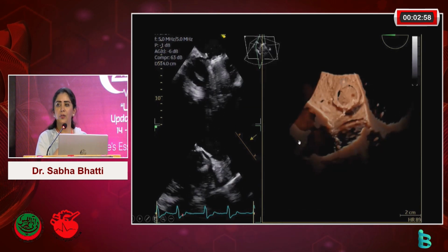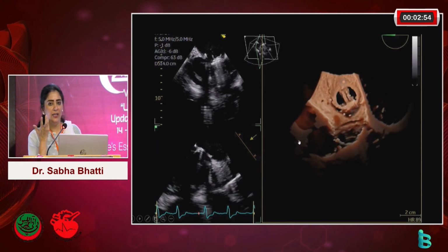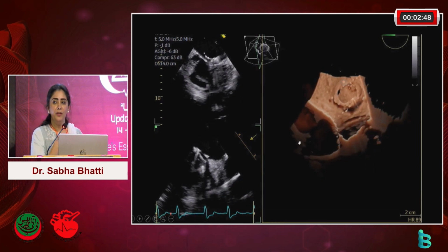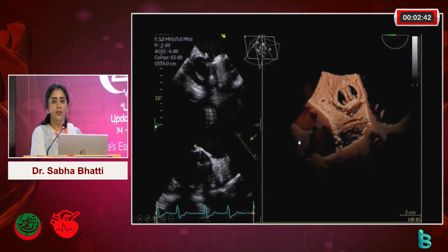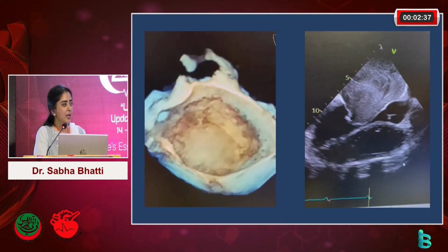I think many of you remember, and I still remember in my training, patients coming in and we're like, oh, is one leaflet stuck or not? Can you tell on echo? I can't really tell. Okay, let's go fluoro them. And we always used to say fluoro is the gold standard. But I would argue when you have image quality like this and your leaflets discs show like that, then you probably don't need fluoro on that case.